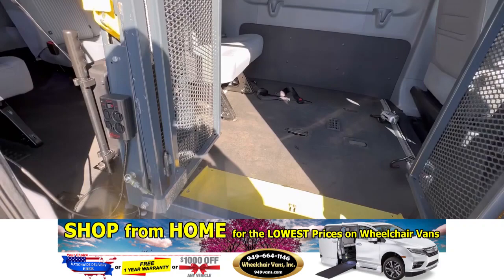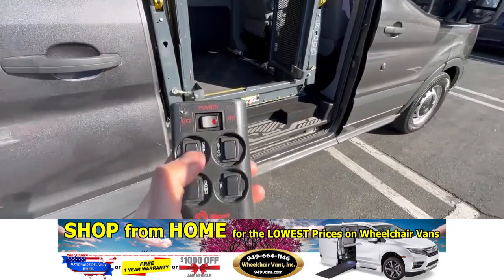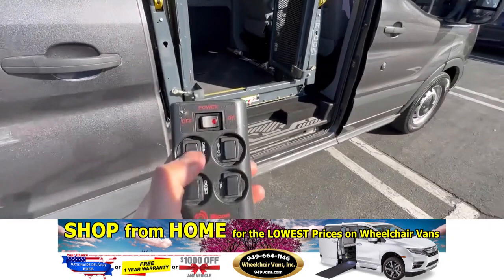Once you open the door, you'll hear a little beep come on. Then to get the lift active, grab your hand pendant — it has an off and on switch. Turn that on, then hit deploy and it will bring the lift out.